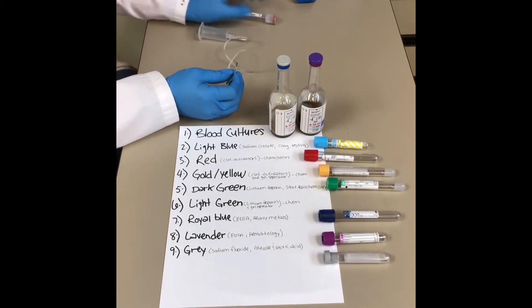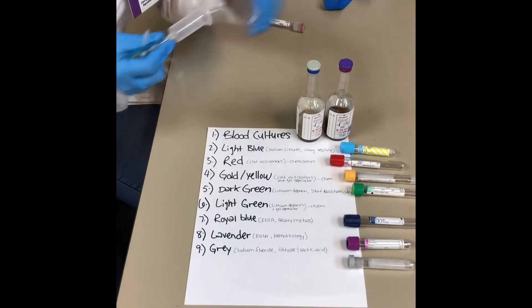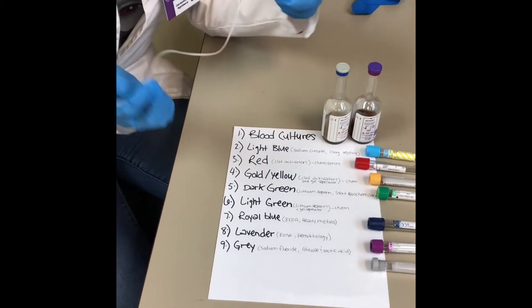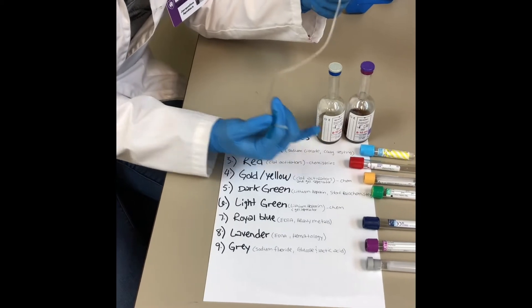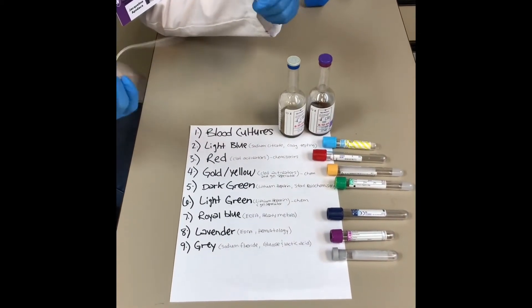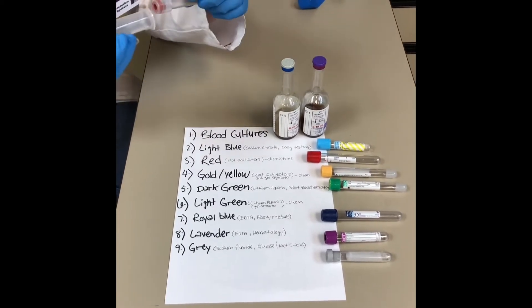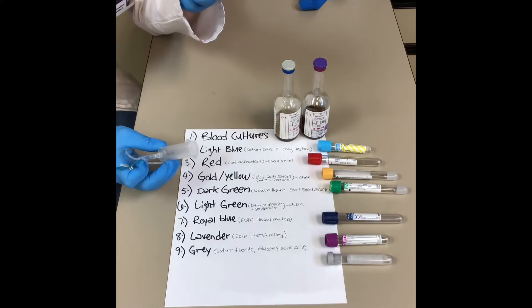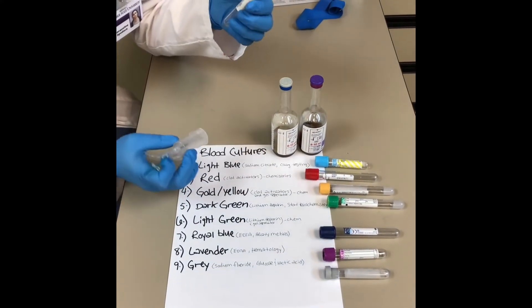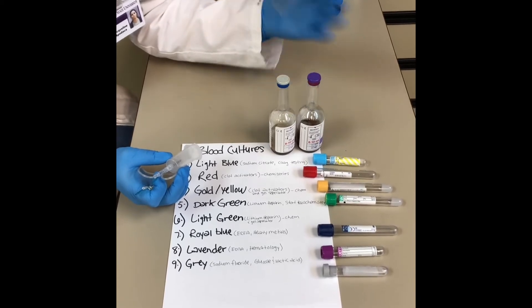With this butterfly, because it has tubing, we have to use a waste tube because typically the first tube we draw is the light blue. That has a one-to-nine ratio that's really important, so we want to make sure it's completely filled with blood. Before you draw your light blue, you have to have a waste tube — it can be a red or another blue — just something you discard before drawing into your light blue for testing.